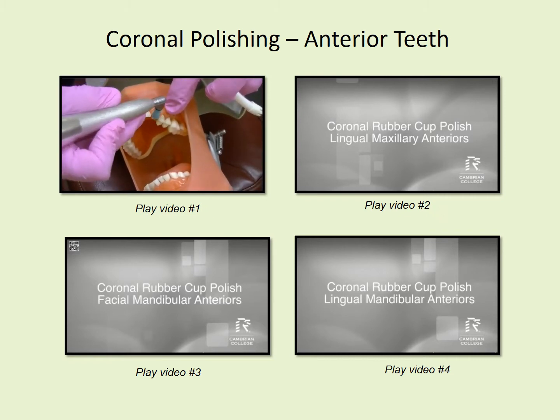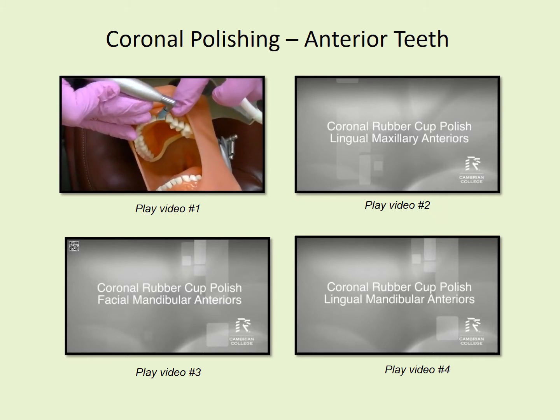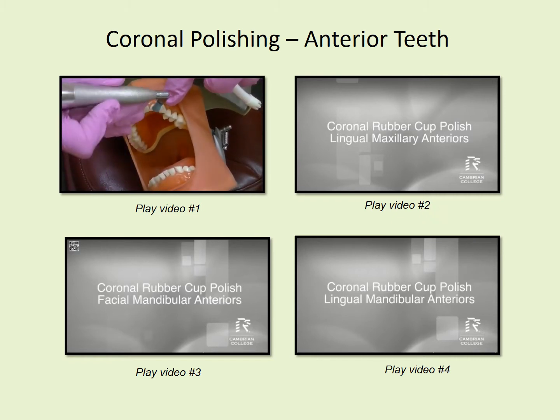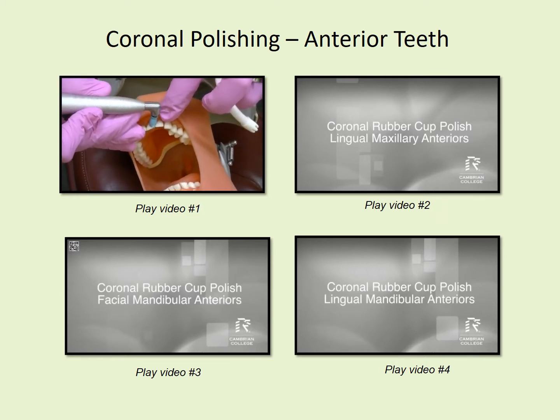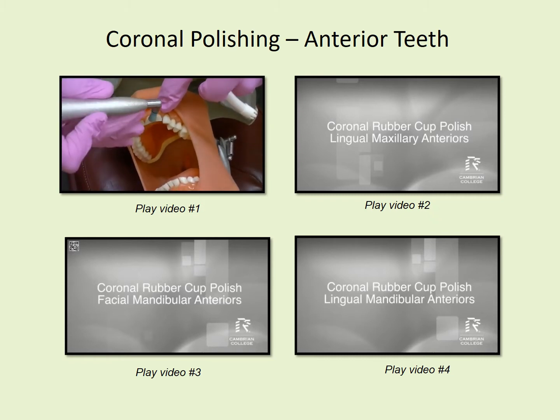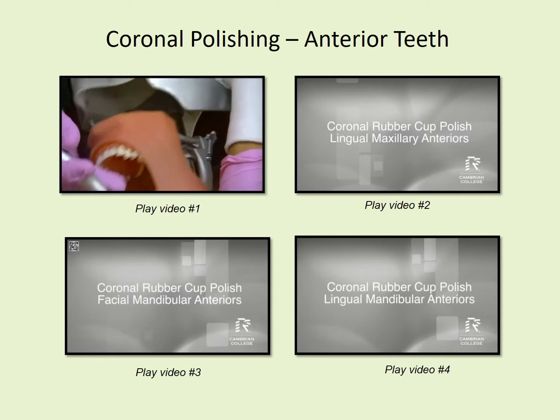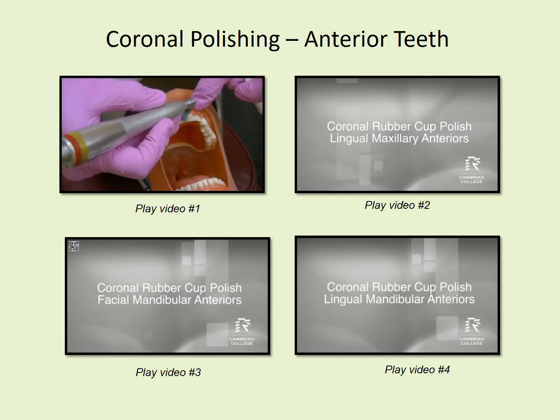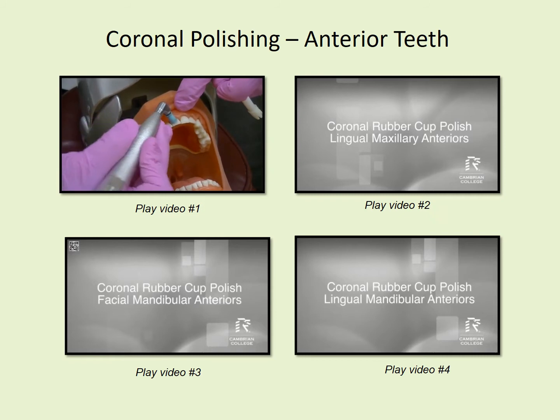Again, longer tooth, you'll need to do a couple of sections if there's stain. And as you get to the centrals, you'll start asking the client if they could straighten their head up. And by the way, we're at 11 o'clock for this position.